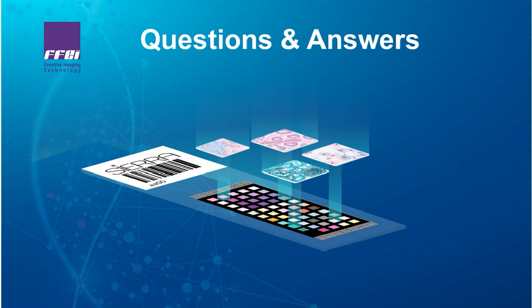Yeah, thanks. So there are various points in the, should we say, the end-to-end pipeline of the digitization process and the viewing process that the profile can be applied. In one format, you're quite correct. Interaction with the scanner manufacturers can allow for these profiles to be embedded at the point of writing an image, and so that intuitively these profiles and all the high degree of accuracy and standardization the slide provides can be there in the raw image.